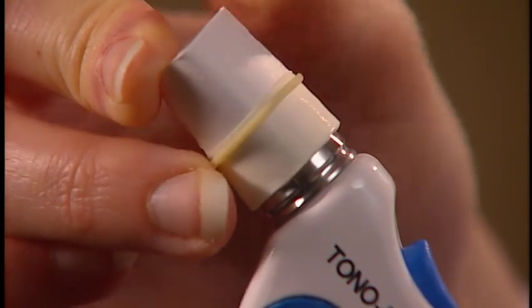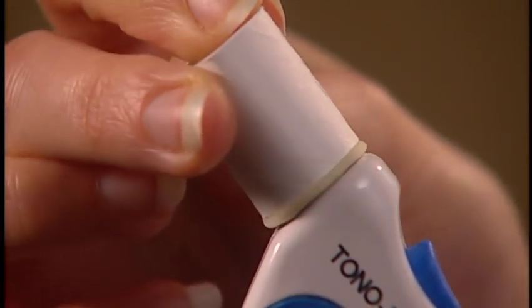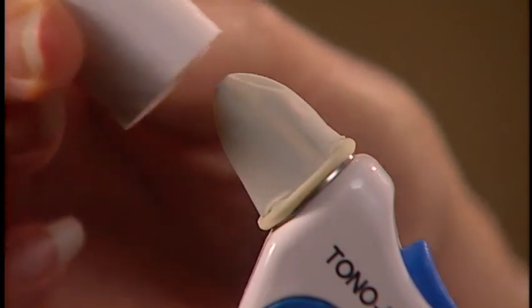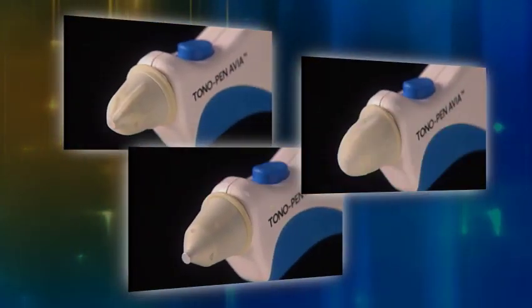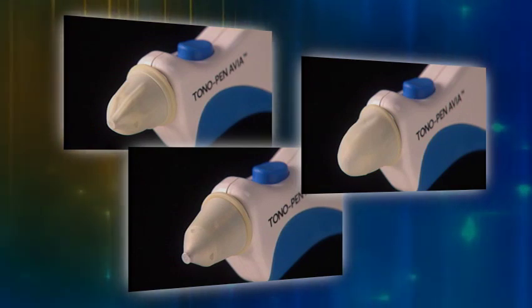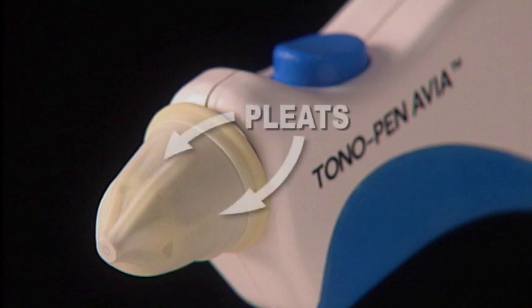Occufilm Tip Covers are very easy to use. They are simply rolled on using the integrated cardboard applicator. Care must be taken to ensure that the Occufilm Tip Cover is not applied too tightly or too loosely over the transducer. This illustrates a tip cover with the proper tension. Pleats like these should be seen, indicating the correct tension and allowing the transducer post to move freely.